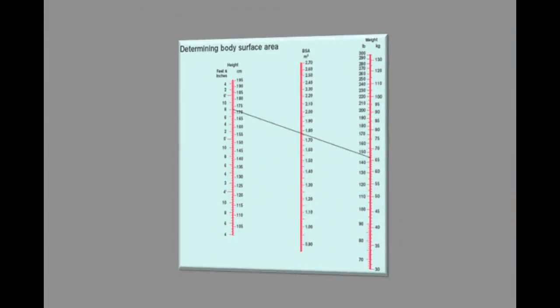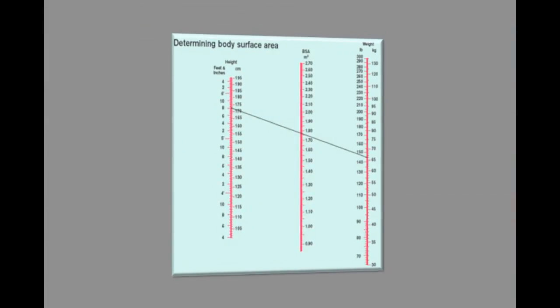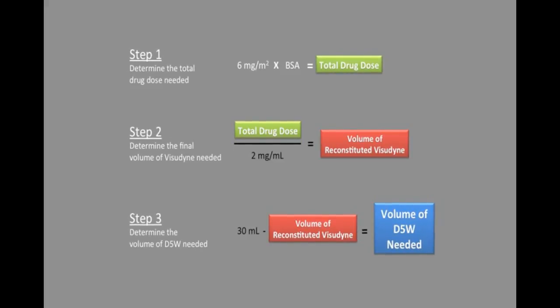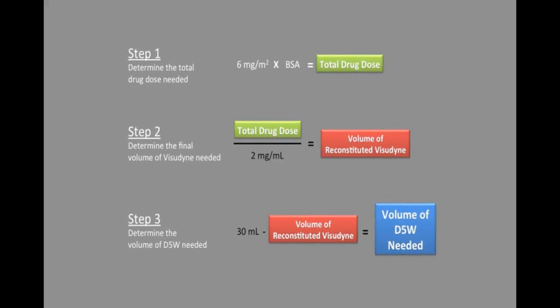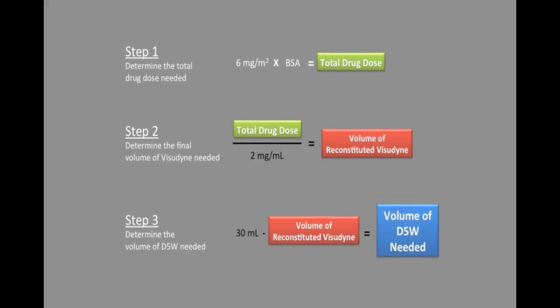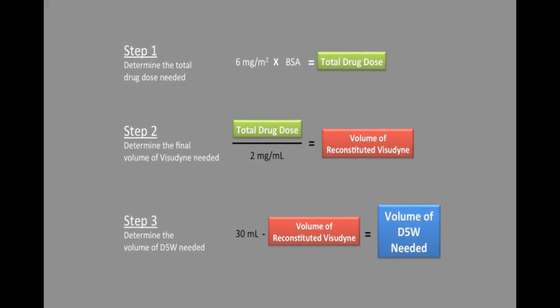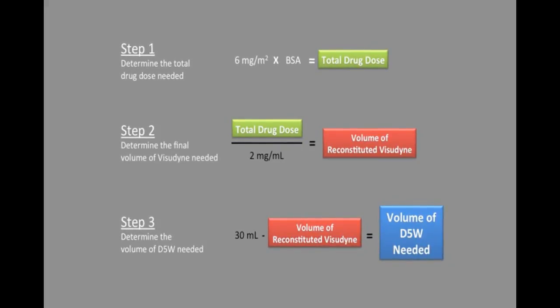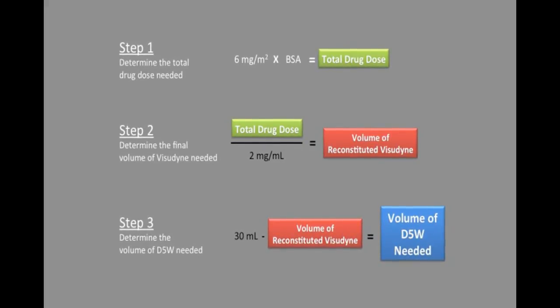Next, using a standard BSA nomogram or the standard formula for BSA, calculate the patient's BSA to determine the appropriate volume of reconstituted Visudyne solution that you will need to achieve the desired dose of 6 mg per m² of BSA. Subtract that volume from the total 30 mL infusion volume to determine the volume of D5W needed.